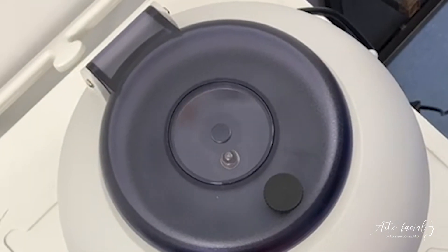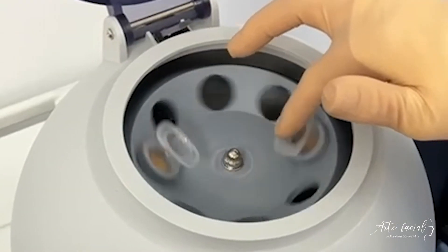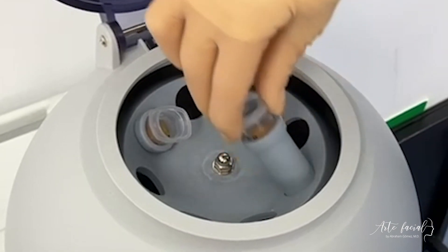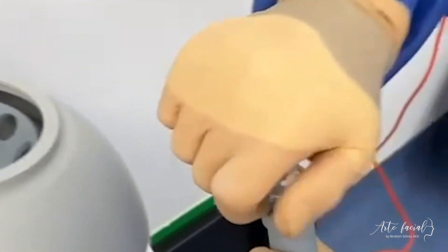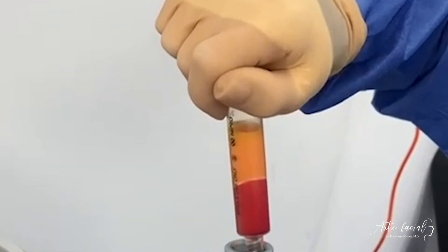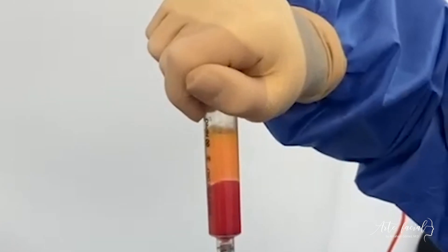The centrifugation process separates the fat from the water and oil fractions of the harvest. The fat is spun for about two minutes at 1000 rpm. The syringes containing the fat are carefully handled by the scrub nurse, making sure to maintain sterility throughout the whole process.